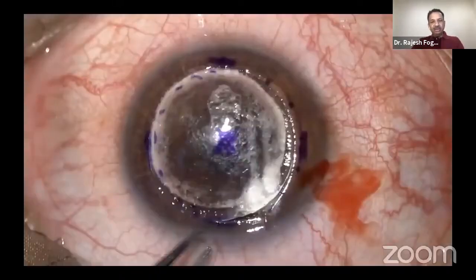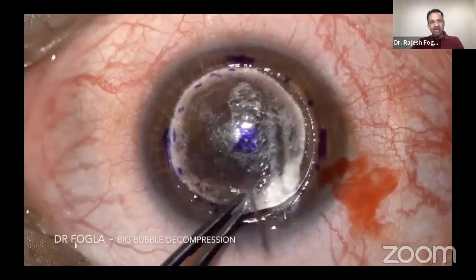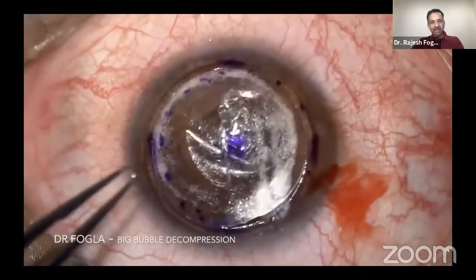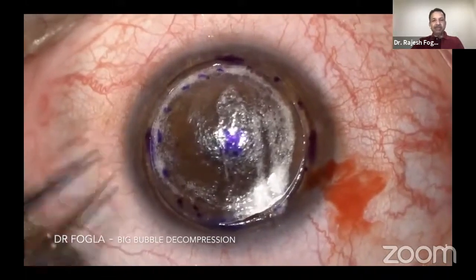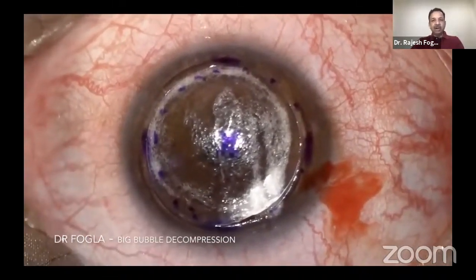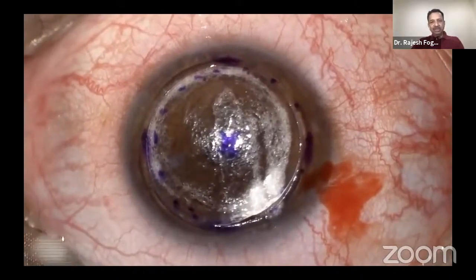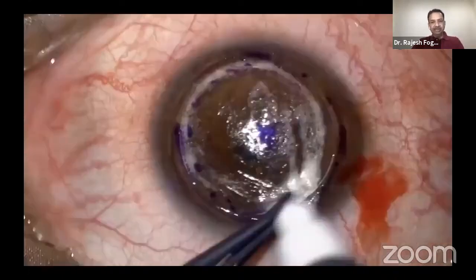I like to release my speculum to reduce the counter pressure from the posterior pressure, and I do a paracentesis, make the eye soft, and then I mark the cornea where I'm doing the paracentesis. And you can see that as you do the paracentesis here, the posterior layer does not snap back very quickly. It comes out gradually because the counter pressure is minimal. So it's important to loosen your speculum and do a paracentesis, release some fluid from the anterior chamber so that the counter pressure is minimized. So you can do a deflation in a much safer manner.